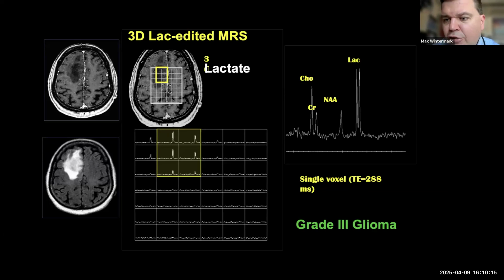The downside is the duration of the acquisition, because of course it takes a lot longer. And of course, you are trying to detect those minuscule differences in terms of the frequency of resonance, and so you need the patient to be perfectly still. For perfect patients who can stay completely still for the duration of the exam, the 3D spectroscopy is great.